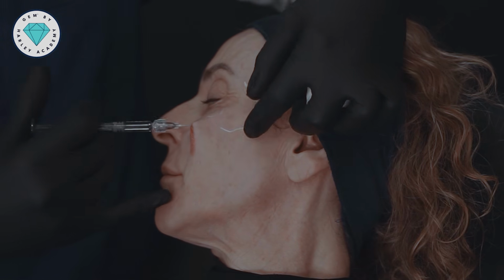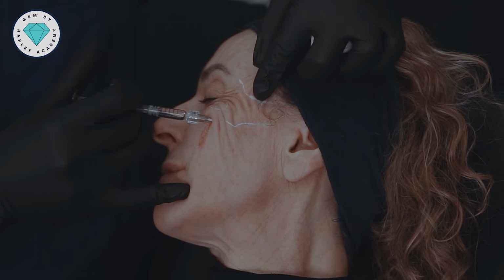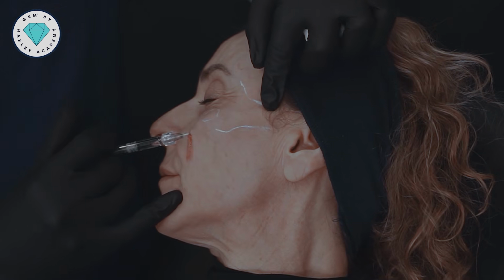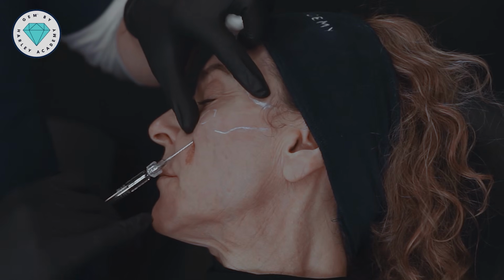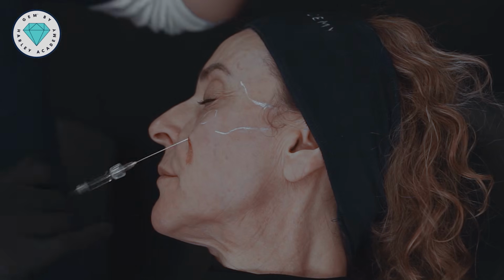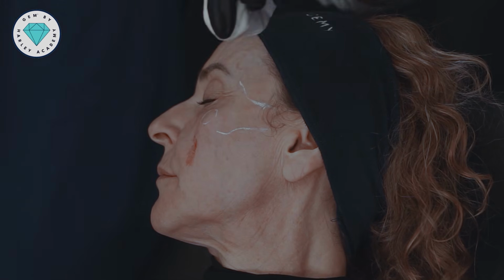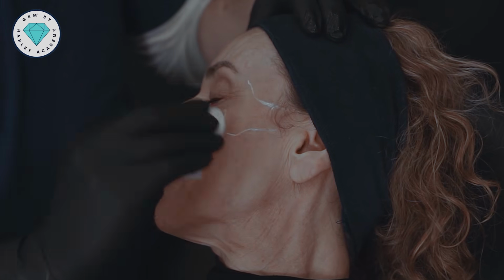Just trying to create as much of a smooth transition here from the lateral zygomatic arch through to this apex that I've created at the cheek. And that's half of the syringe of filler used for that treatment. So we can just take a look now.